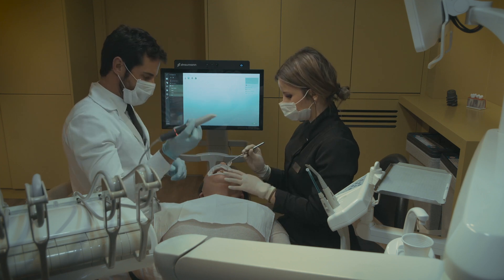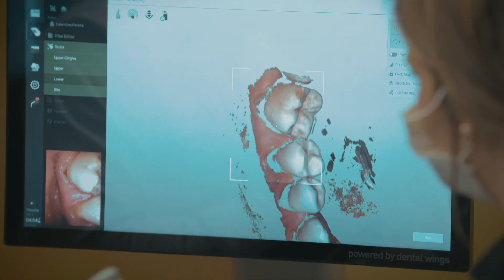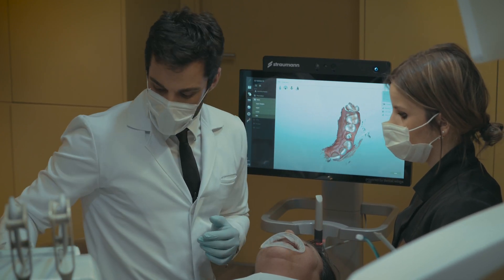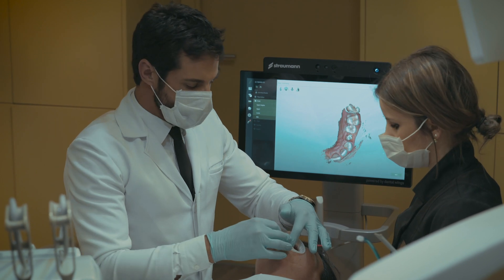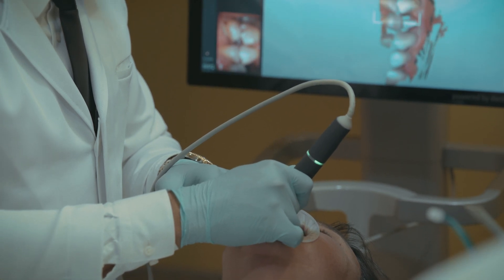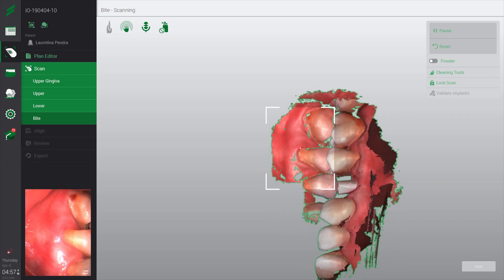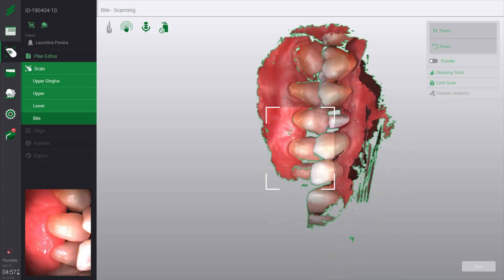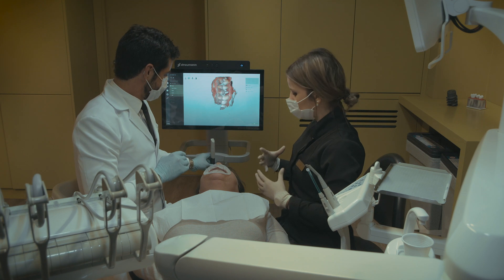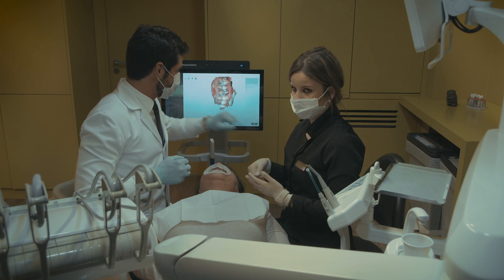Now let's go to the lower jaw. In this case, our scan body interferes with the occlusion — with the bite — so we need to remove it before asking the patient to bite. We already have the upper jaw as a reference, and now we just have to scan the lower until we have the model. We have indicator lights — a green light tells us that the scan is OK, helping us stay centered on the patient.